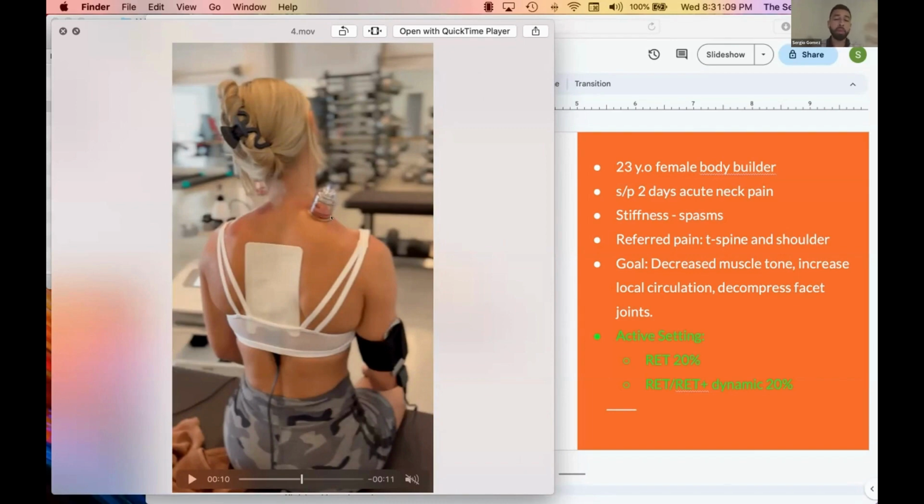At the same time, just throw in a little cupping, decompression, just to open up some circulation in the superficial layers of the shoulder area. Certainly was beneficial too. Another setting that I used was the RET bracelets. This was my 3rd setting with her.